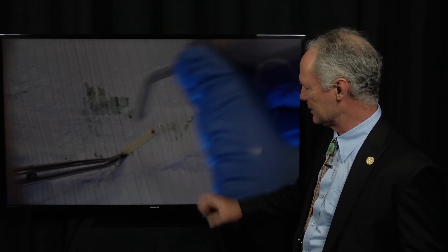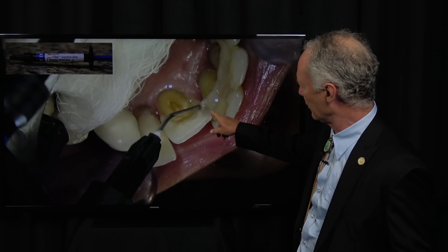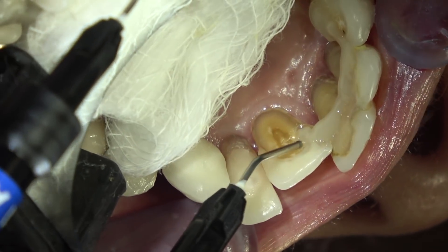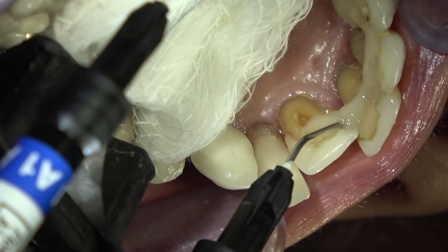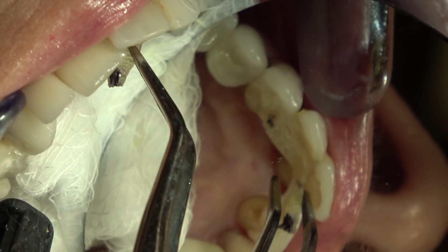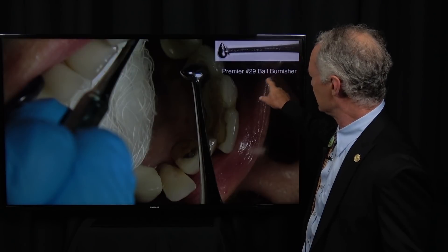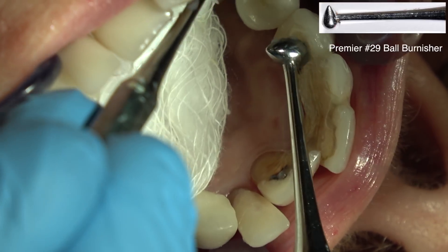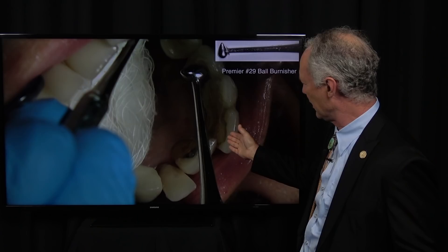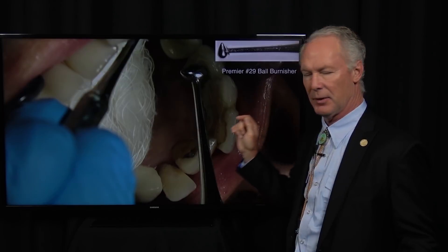Then I'm blowing off all the excess — I'm not curing it though, because it would make it stiff. Then I'm placing flowable composite along the palatal surface of these teeth, where I'm going to place the ribbon. Do not cure this. Place the ribbon onto that unset filled resin, and then use a ball burnisher to work the ribbon into the filled resin. Now these teeth are mobile, so you're going to need to stabilize them from the facial or they'll move away when you touch them with the ball burnisher.